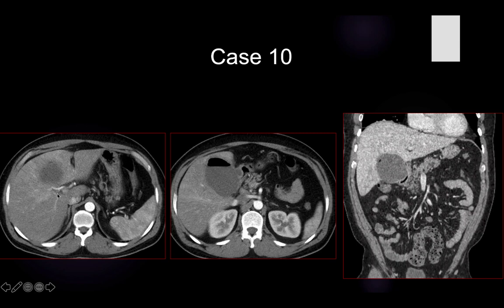In this case number 10, we can clearly see that there is a well-defined cystic lesion that has a wall appearance and also an air fluid level. This is actually an example of abscess formation in these locations, which is segment 5 or segment 4B and 5, and also extending into the gallbladder fossa. This is a patient after cholecystectomy who comes with a high grade fever. So this is an example of a gallbladder fossa and hepatic abscess by the typical appearance of the abscess showing wall formation and also an air fluid level.